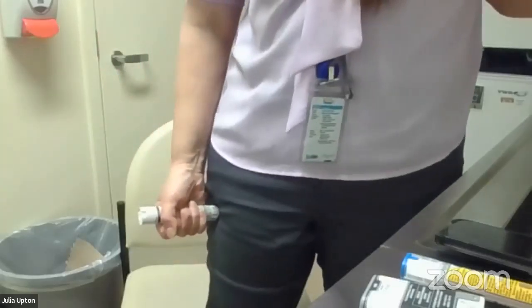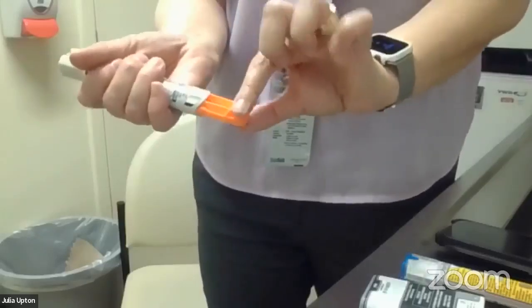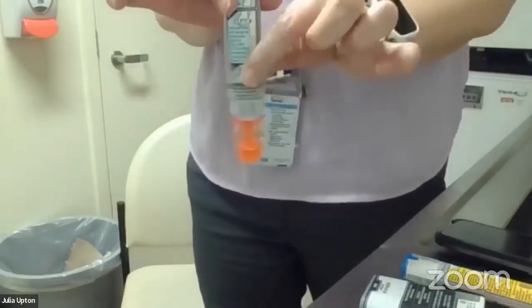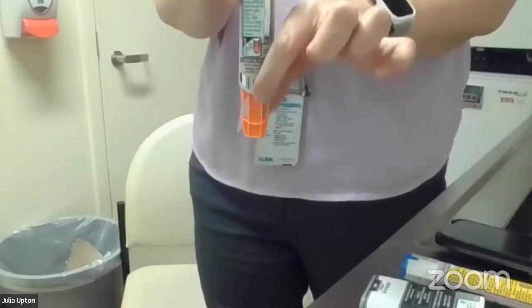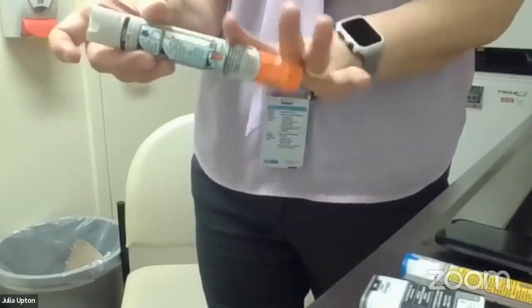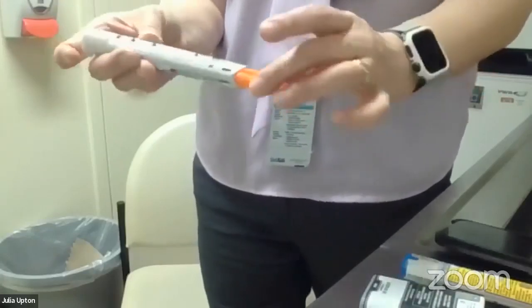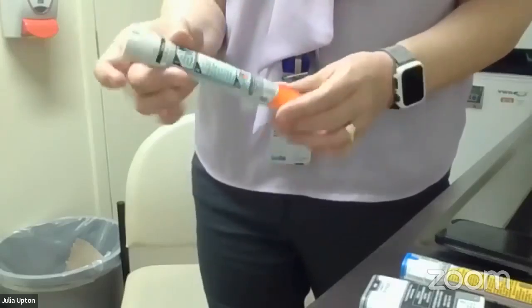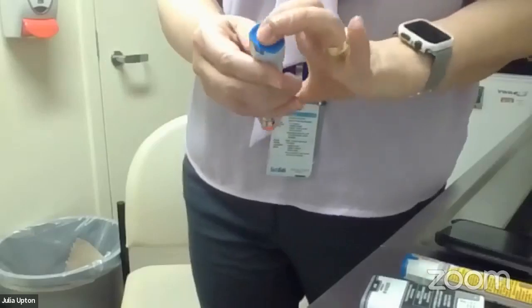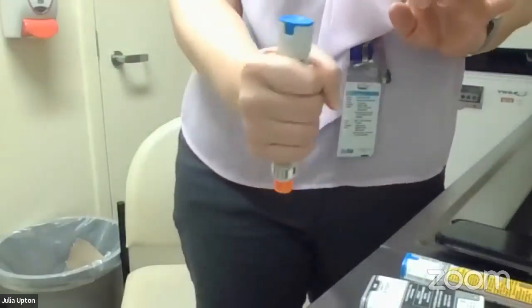And then you can see, as I remove it, the orange piece is now covering the needle. And so, this is a fake one. There is no needle here, but on the real one, the needle would have come out, and then as I'm removing it, the orange bit is shielding the needle. That's how it works. And so then for this demonstrator, I can now squish all of that back in and put the back on again and be ready to use another time. So just to do it maybe without all the talking. So I'm holding it.